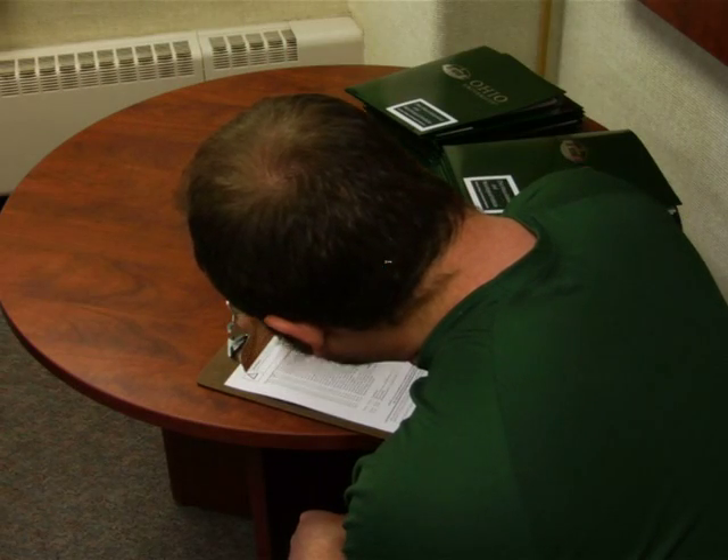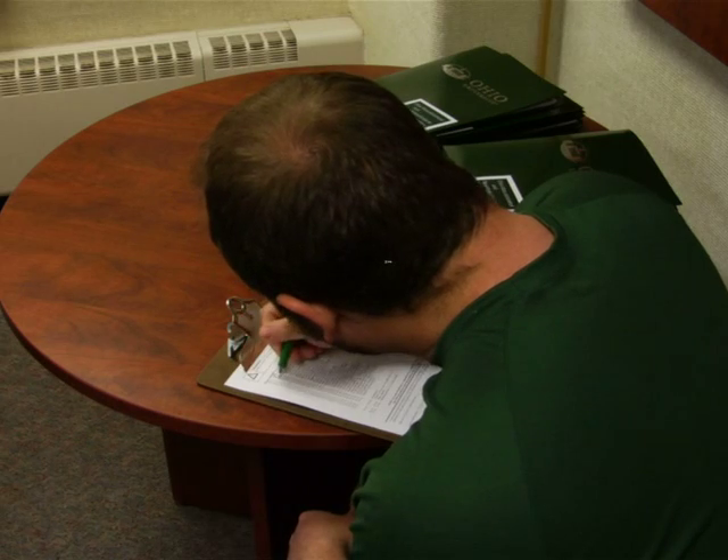Before beginning the TMS experiment, first screen the subject following the screening guidelines set forth by the Institute for Magnetic Resonance Safety, Education, and Research. Exclude individuals with a family history of epilepsy or seizures.